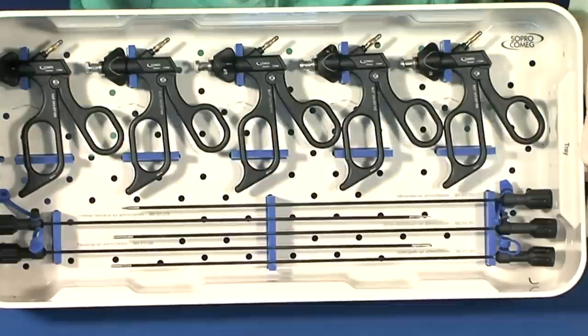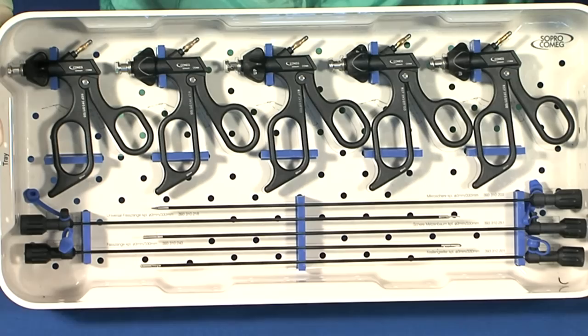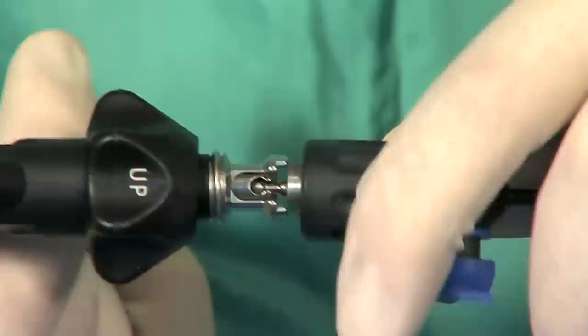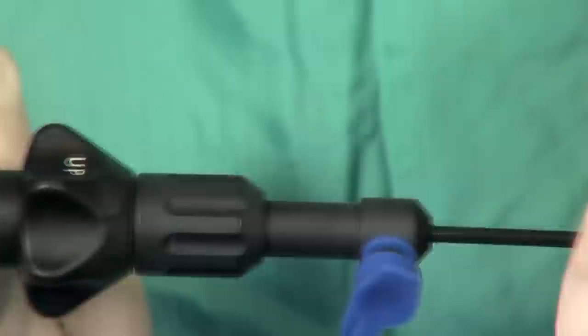The forceps and surgical scissors are composed of an insert and a hand grip, made detachable to ensure impeccable hygiene. When assembling the instruments, the hand grip must be held open and the ball of the insert introduced into the slot designed for this purpose. The hand grip must then be closed and the insert ring screwed on.